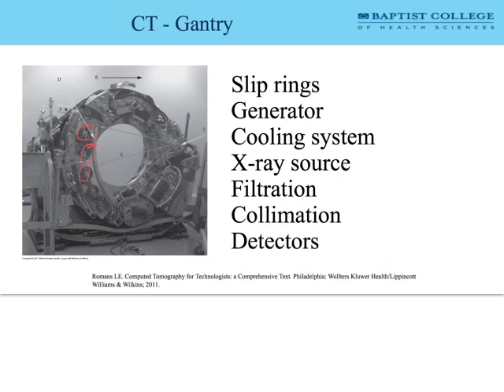The thing that we like about these compounds is they have a high atomic number and a high density compared to things like xenon gas. So they're going to stop the X-rays and they're going to detect the X-rays. Those are two different things that lead to what we would call a detective quantum efficiency, a DQE. They have a high DQE because they're able to stop the X-rays and detect the X-rays. If you look at the top of page 118, it says solid state detectors have high absorption coefficients. They absorb nearly 100% of the photons that reach them. That's really great. We like that.